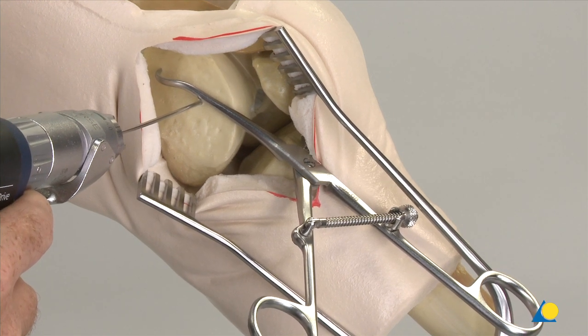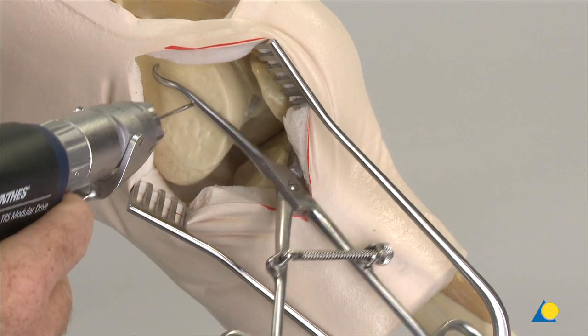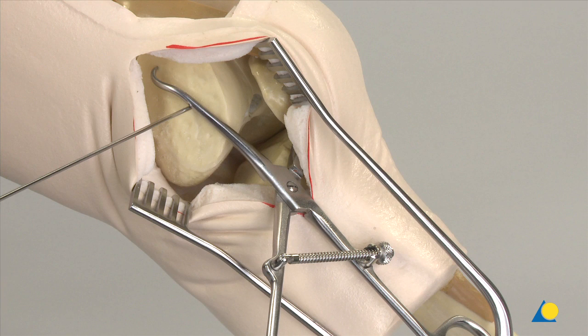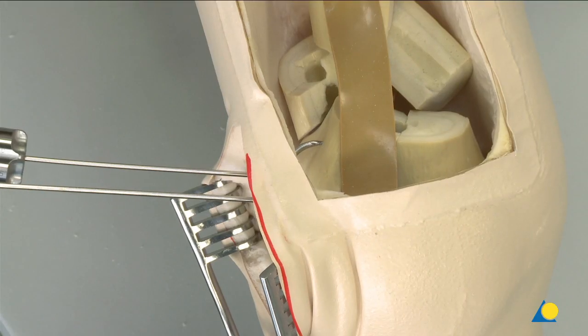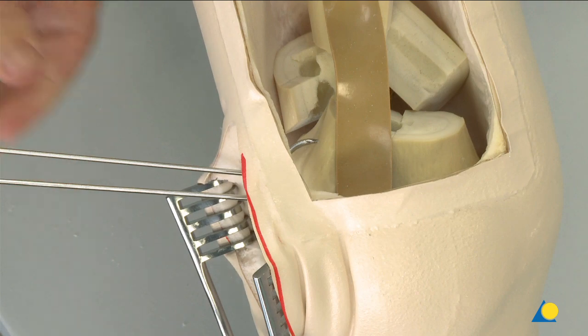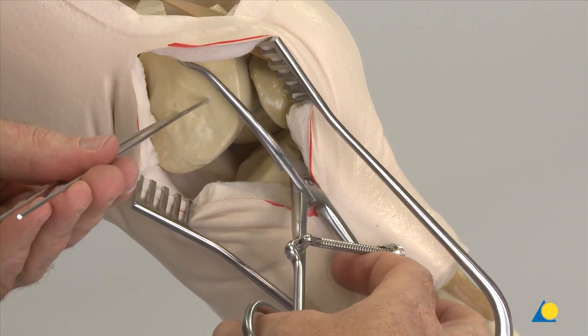The reduction is first secured with two centrally placed K-wires. It is important to use two K-wires to ensure rotational stability. The reduction forceps are now removed.